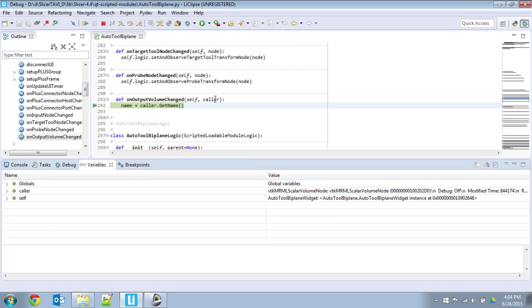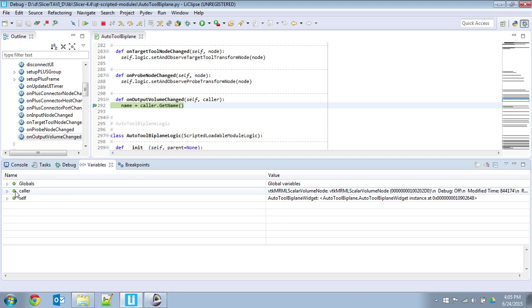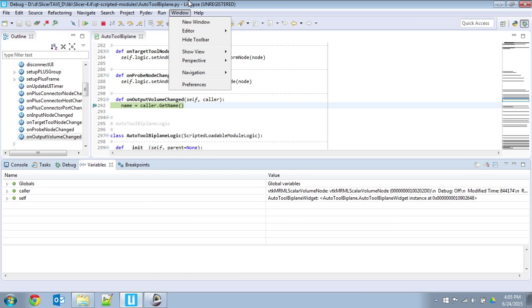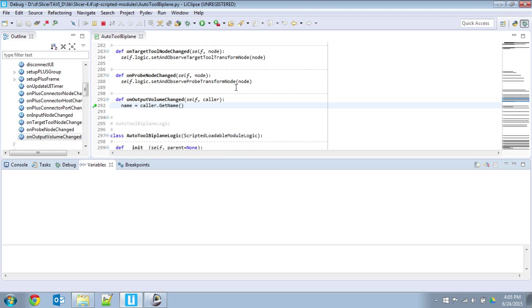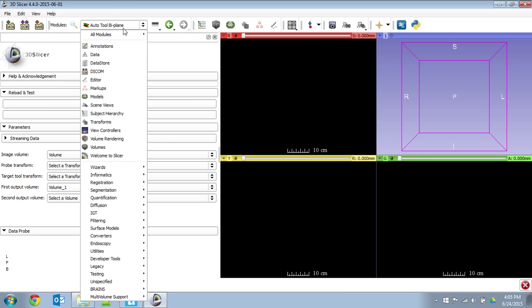Here's the caller, which is a parameter to the function. You can see that it's a scalar volume node, and it has a bunch of values to it. Also has some constants. Well, the class has some constants, but basically you can explore. There's step-through debugging, so you can have your classic step into, step over, step return, and you're pretty much good to go. So I'm going to wrap up the tutorial there with a little step return. I remove the breakpoint, and I'm going to go back to Slicer, which is responsive again.